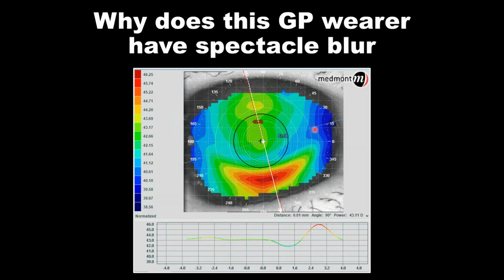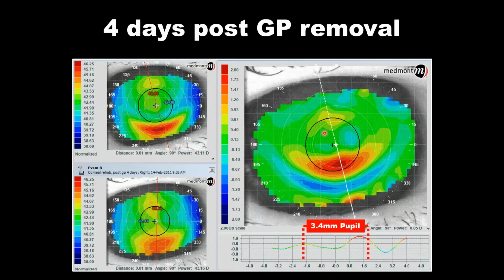We've got this big smile down here. We've got this arc of flattening running right through the cornea, which isn't very typical of a normal, disease-free, non-surgical eye, which this was. Well, let's do a subtraction. And when we compare post-removal of the contact lens to allowing that lens to rehabilitate over a period of 4 days, we're beginning to see a figure-8 hourglass astigmatism beginning to form.